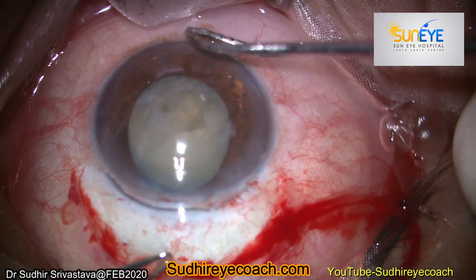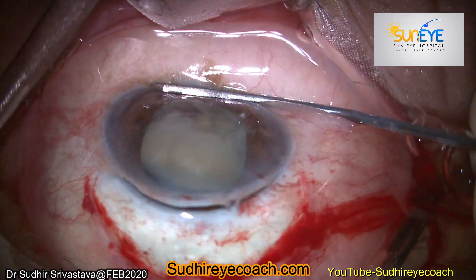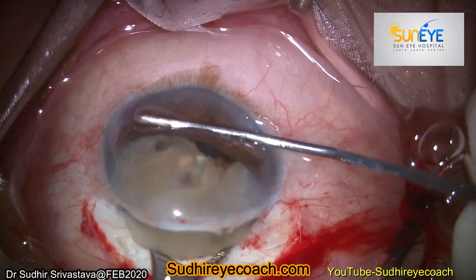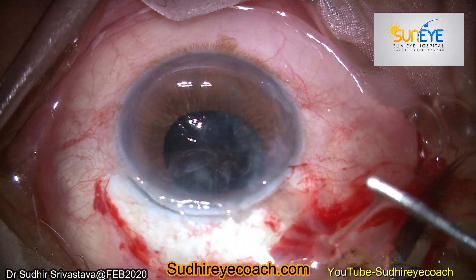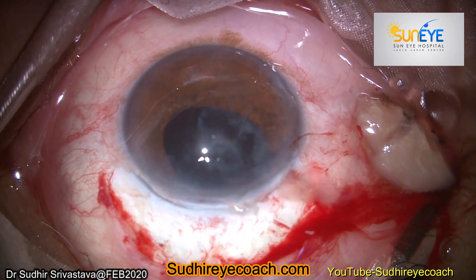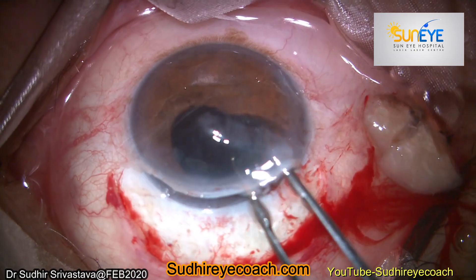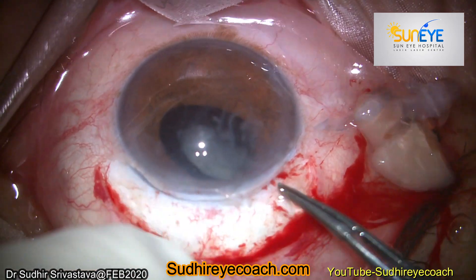Now after making the incision you can realize how big the subluxation was, because the capsular dehiscence was big. So I removed the nucleus in two pieces. Because the whole bag was loose, I removed the whole bag along with the cortical matter present in the bag.